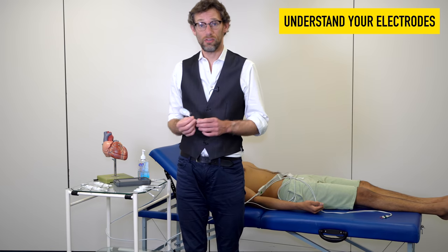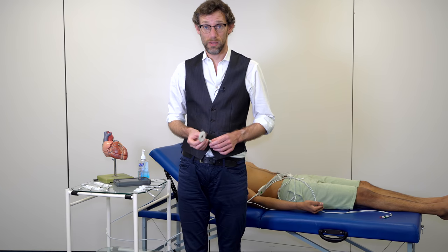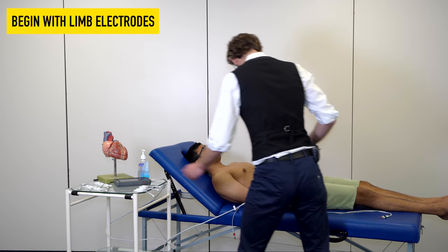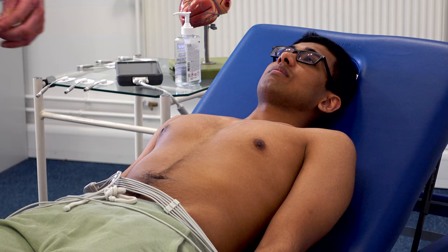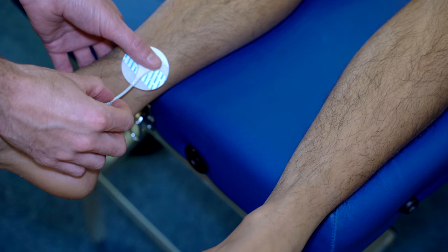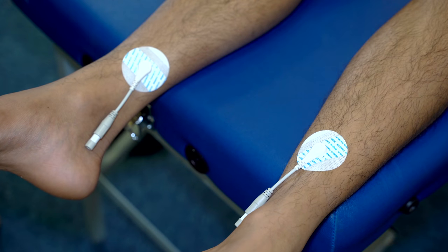Different ECGs will have slightly different electrodes. These electrodes need a slight extension applied to each before you apply them to the patient because of the button end — if you were to apply this afterwards it would be quite uncomfortable. For the arm leads, we want to make sure they're away from any bony prominences, applying them directly over the skin without any crossovers. For the legs, we apply them over the inside of the ankle. However, positioning is not absolute — as long as your ECG leads are on the limbs and not over bony prominences, that is acceptable.